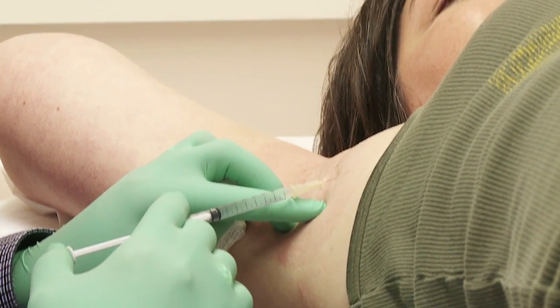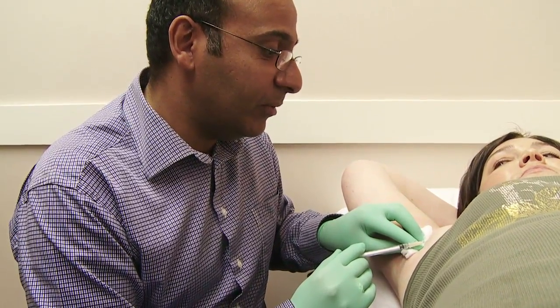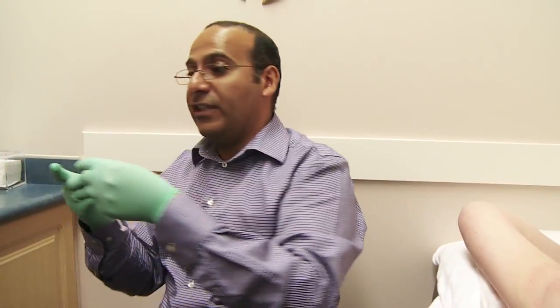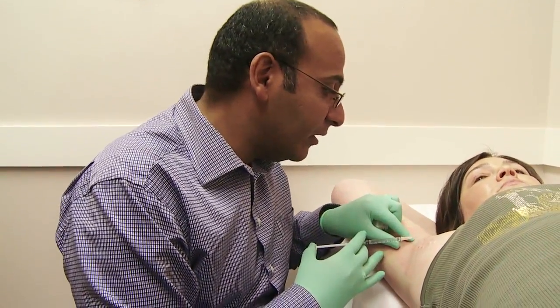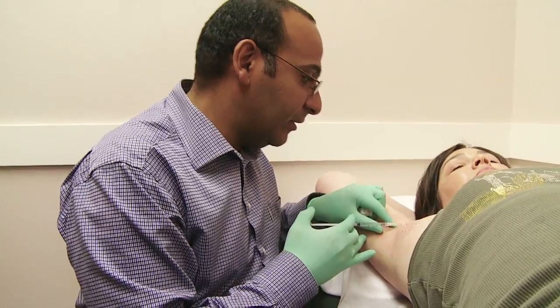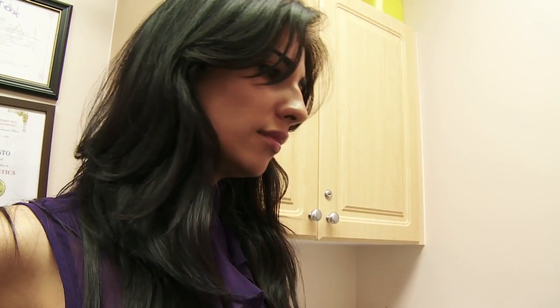So what are you doing? Are you going into different areas now for the sweat glands? How exactly does it work? What specific areas? What we do in this situation is we inject all over the underarm area, over the areas in which sweat is coming out. And how do you know what area to pick? I'm seeing how you're doing different areas around. It's generally experience. As well, we do a starch iodine test on the first day that the patient comes, which we didn't show in this situation, but that way you get an idea of where the sweat is coming out. And it's an excellent question, because people who've had previous surgery will have a bit of a different pattern of sweating. So we're generally covering the whole area in which she's sweating, so that she'll have good coverage, and again, it will last on average 7 months or so.